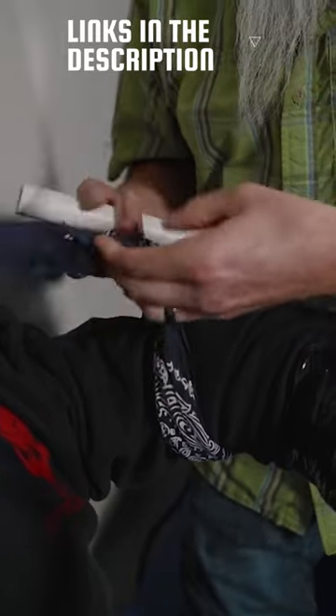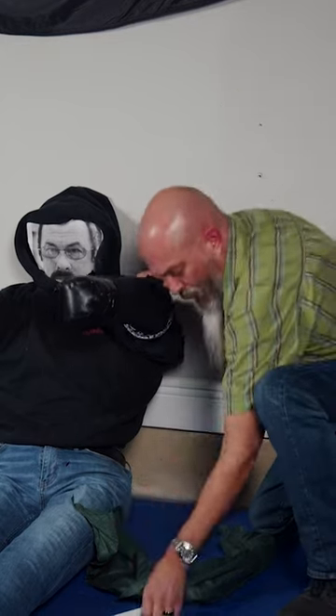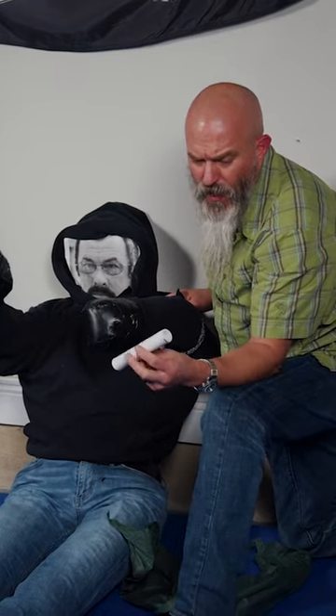...our little fella's elbow right here. I'll put this on here, tie it with a double knot, make sure it's nice and tight, then insert our improvised windlass — I have a piece of PVC here. You could use a wooden dowel. There was one video I did earlier where I just grabbed the MDV and used it as a windlass.